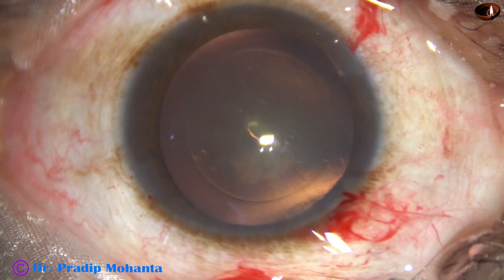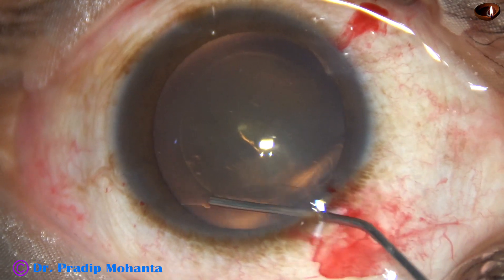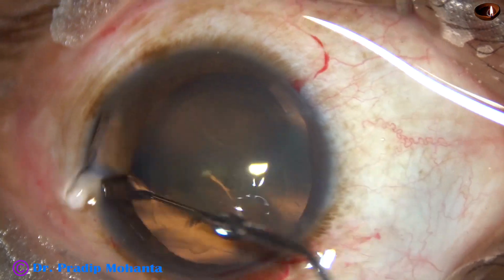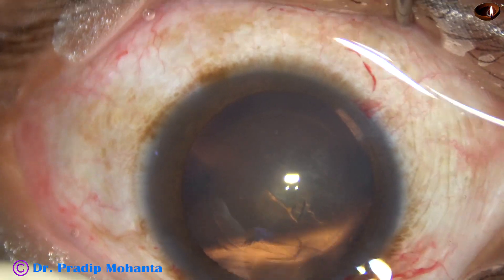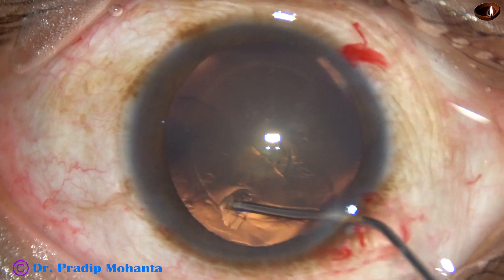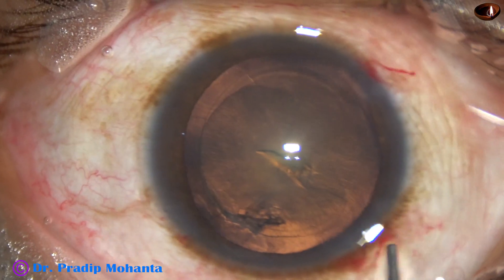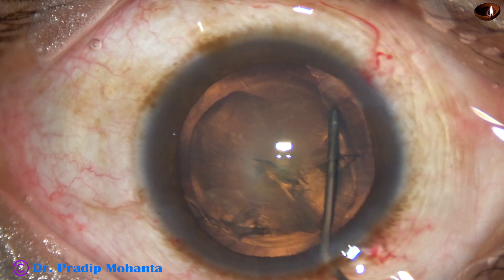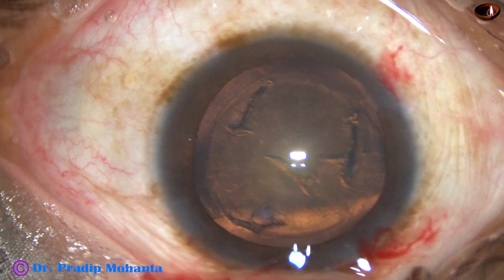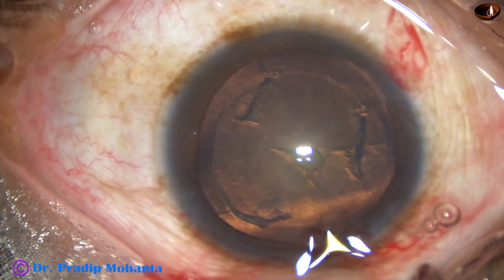And now, hydrodissection. BSS is passed just under the anterior capsular rim. BSS is passed and hydrodissection is also attempted. The cataract is so soft that I don't try to rotate the lens mass.